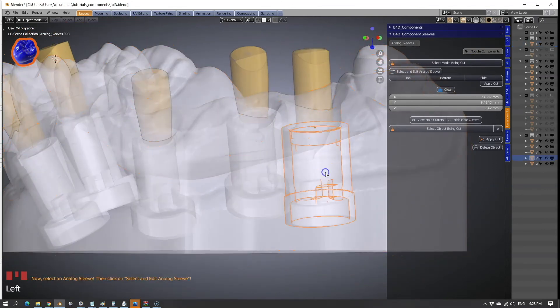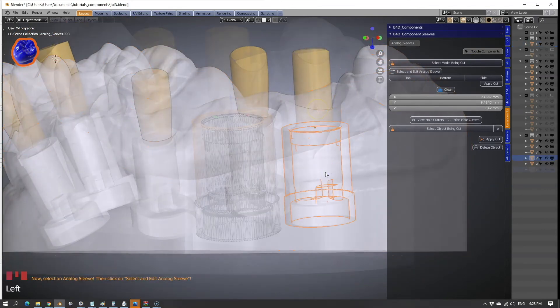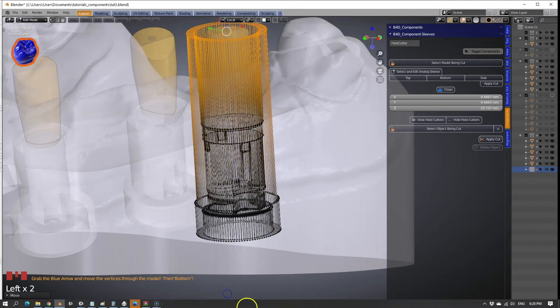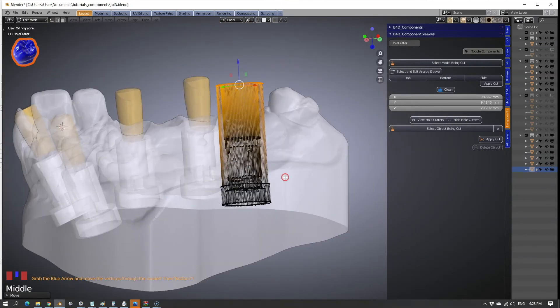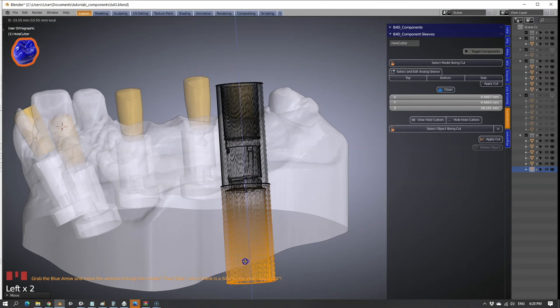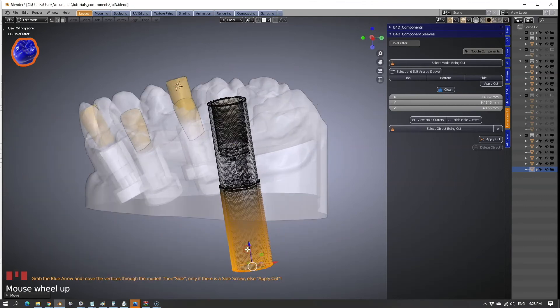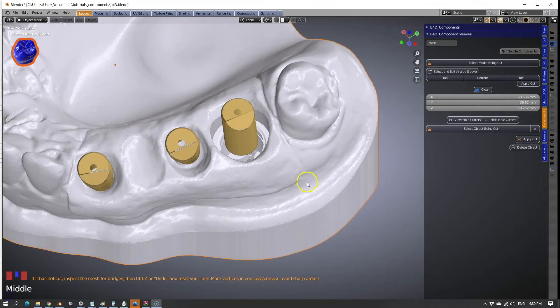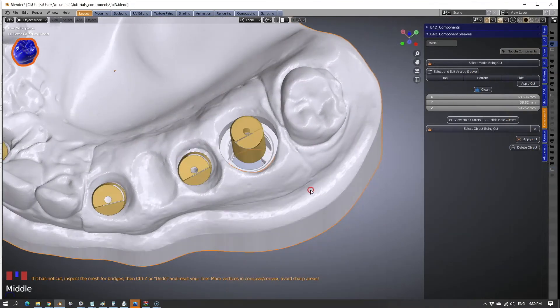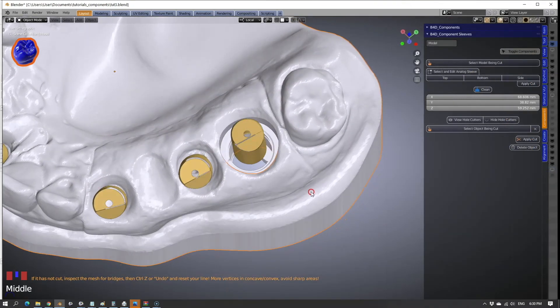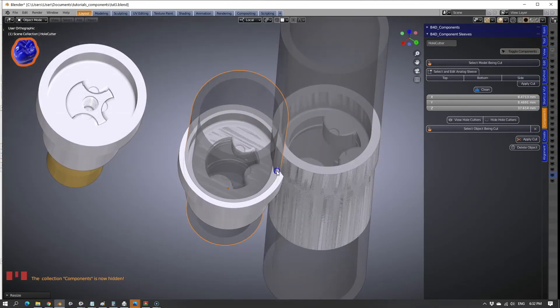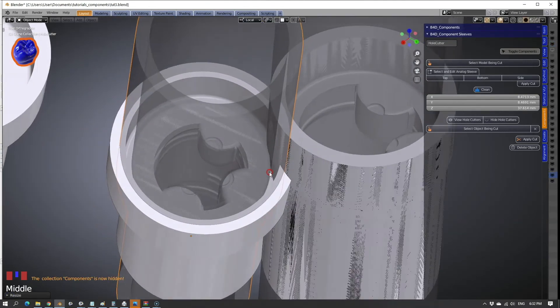Special cutting tools are used to create the cavities in the model for the analogs to fit into. The tutorials will guide you through the process one step at a time.